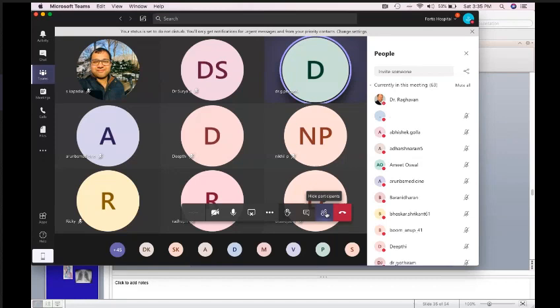Sir, some people also call it the hepatoclavicular view, 20 to 25 degrees LAO and 30-35 degrees cranial. Nowadays, people don't describe it as hepatoclavicular, four-chamber and all. They actually describe what degrees they used. So you describe what you did, like 20 degrees cranial with 30 degrees LAO. That is the best way of describing it.